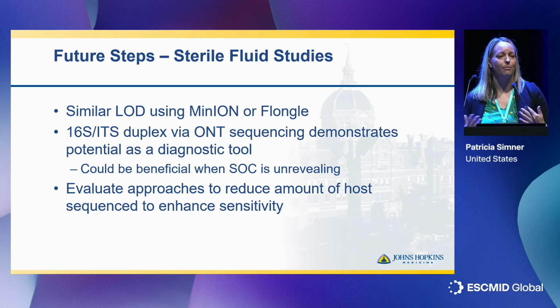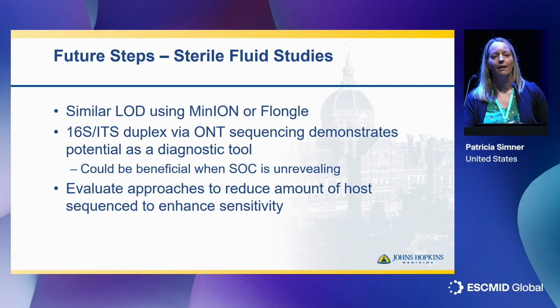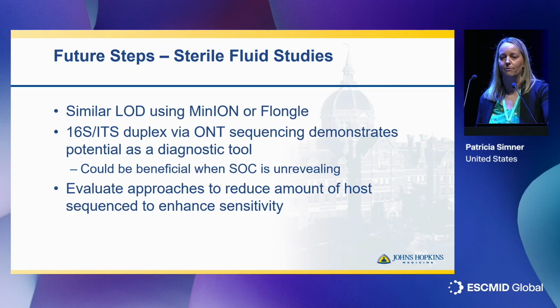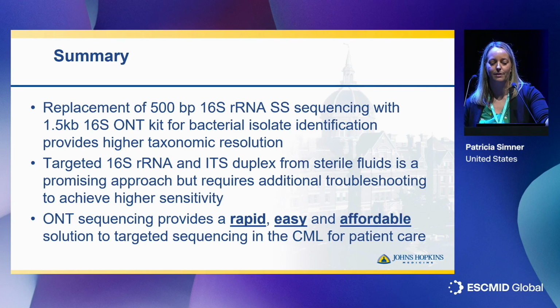This is often the way we're using these tests right now in the clinical lab: when things are unrevealing by our standard of care methods, we proceed to next generation sequencing based modalities, where this could be helpful in cases where the patient was previously treated and we want to identify the potential etiology. We also are going to evaluate future approaches to reduce the amount of host being sequenced to help enhance our sensitivity. So again, it shows the promise of this, but still a little bit of work to be done.